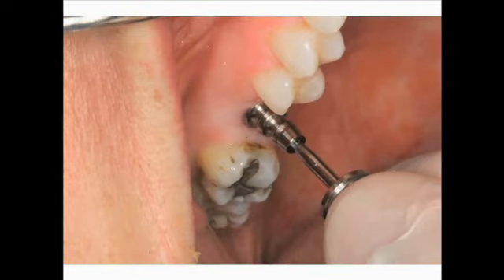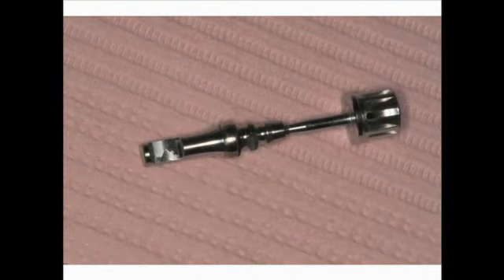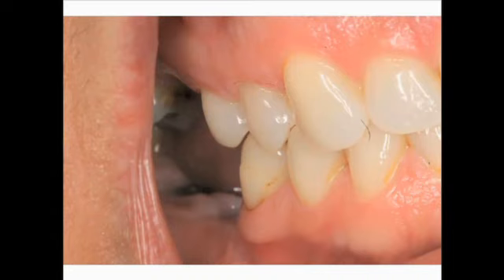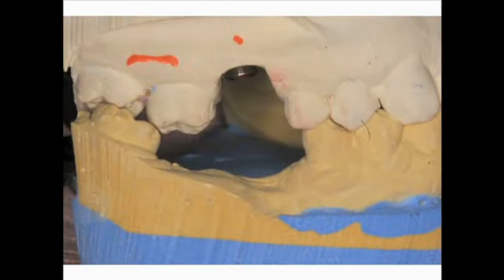The impression coping is removed and placed into a laboratory analog which simulates the implant design. And here we have an analog, and the impression coping is simply hand tightened into position. The impression coping and analog is carefully placed into the implant impression. Now you could allow the laboratory to do this under magnification if you prefer. The healing abutment is replaced in the mouth while the dental laboratory is fabricating a master cast using the implant analog to fabricate the proper abutment and crown.